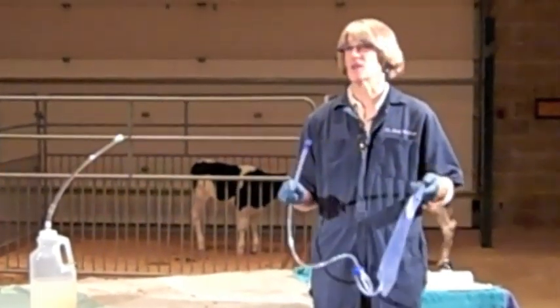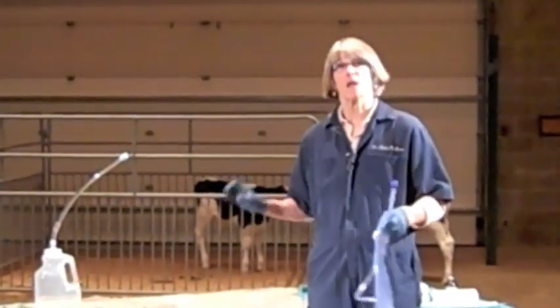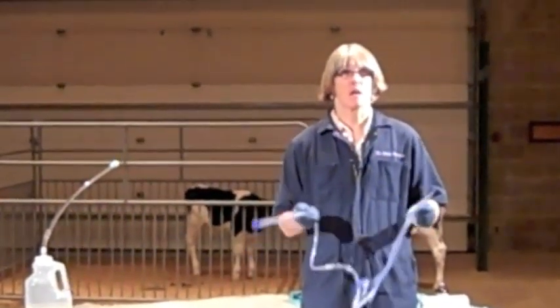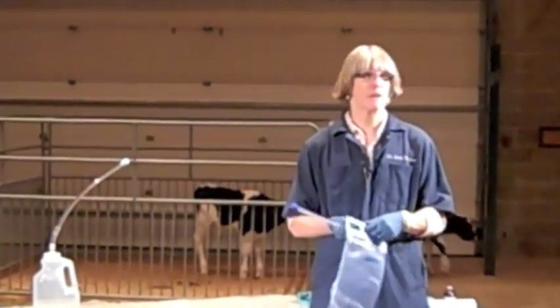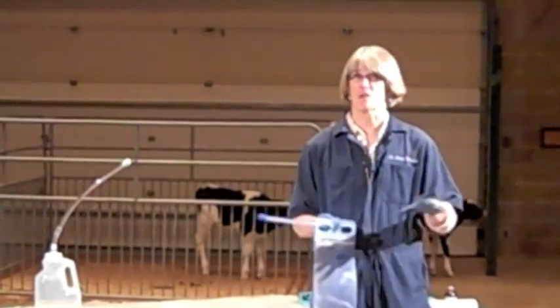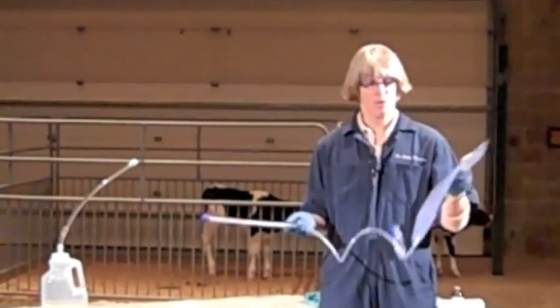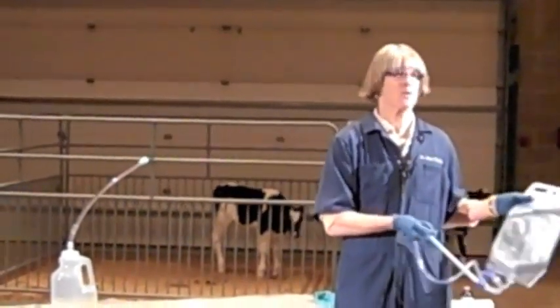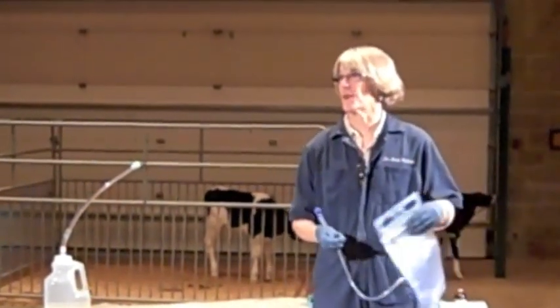I won't force-feed milk generally until a calf has missed several meals. But if they are dehydrated or they have very loose feces — if the manure is watery — they're going to get two quarts of electrolyte solution. If it's super watery, they're going to get two quarts twice a day. The two-quart feeders belong in the calf treatment area, because you only need to pass this once and can get an adequate amount into the calf.